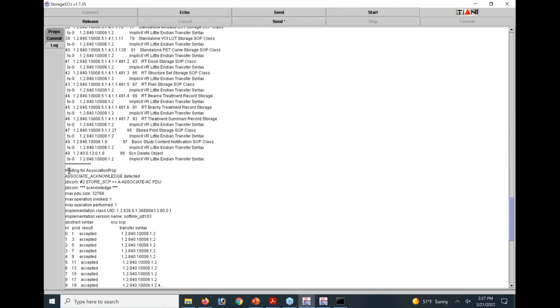Finally, I get down to here. Everything above what I've highlighted is part of which PDU? This is PDU 1. And now we have association AC. What would that be? Acknowledge. So now, who's talking here, SCU or SCP? The SCP is coming back and saying, I accept your PDU size. I accept your timeout settings. I accept your association type. Little endian, explicit, implicit, compression, JPEG, lossless. I accept it using this format.